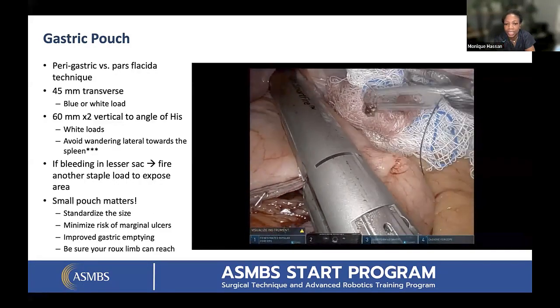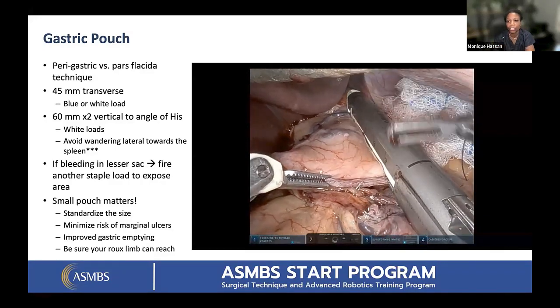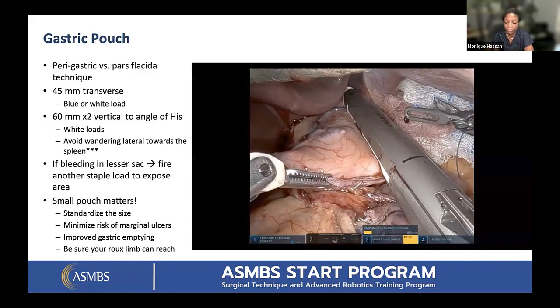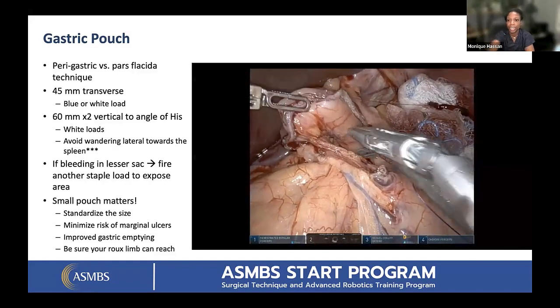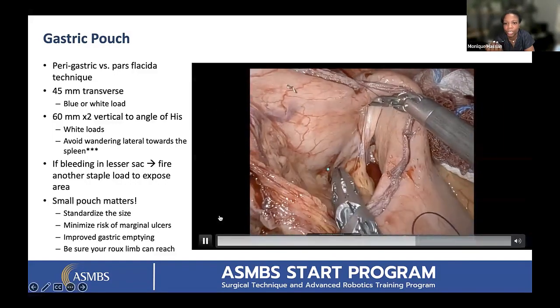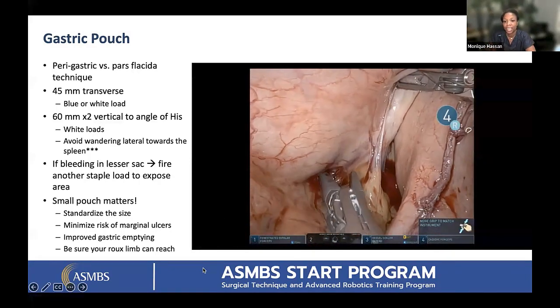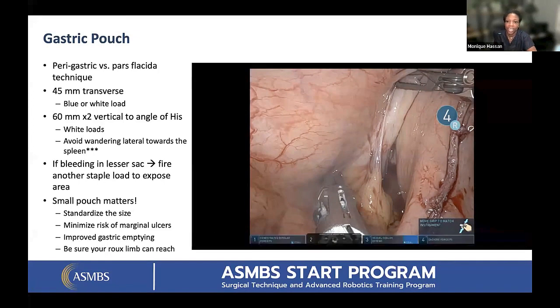But I think that this technique that you're doing, Scott, is really good, because I think for people that are graduating, when they first get out, it's much harder, because I do a 12 and a 3/8. And I think this nice straight angle for making your pouch along that lateral wall is really nice. When I first started doing some of my robotic gastric bypasses, I really liked having that 12. But I was going to ask you at the end if you find that it's really hard to close that second 12.